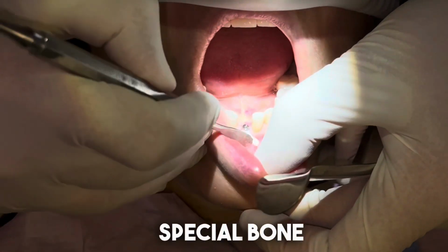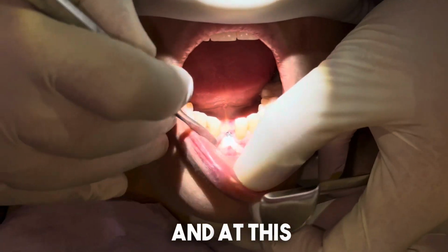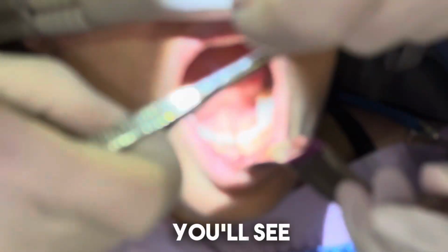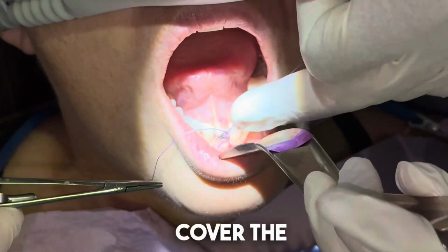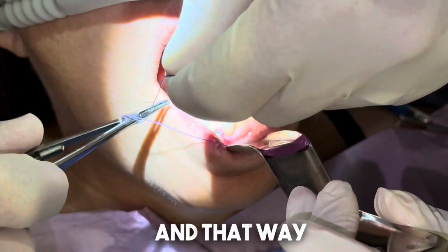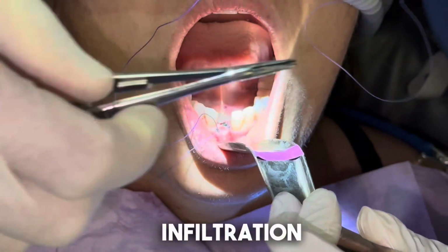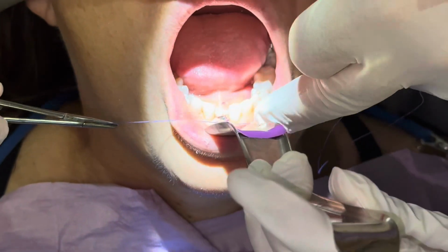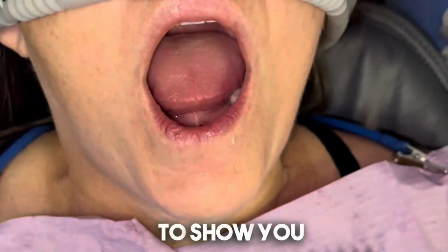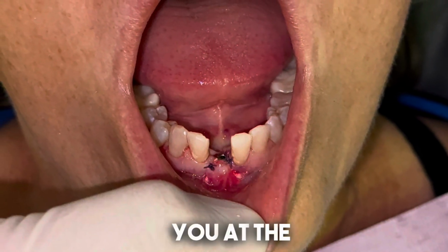Okay, this is a special bone that we use, and at this point we're going to stitch everything back, and what you'll see is that the gums will cover the bone and the implant, and that way it's preserved and there's no infiltration of saliva there, so the bone can heal, the implant can integrate. And now we're going to show you at the end what it looks like. A couple more stitches to go, but we're just showing you at the end.